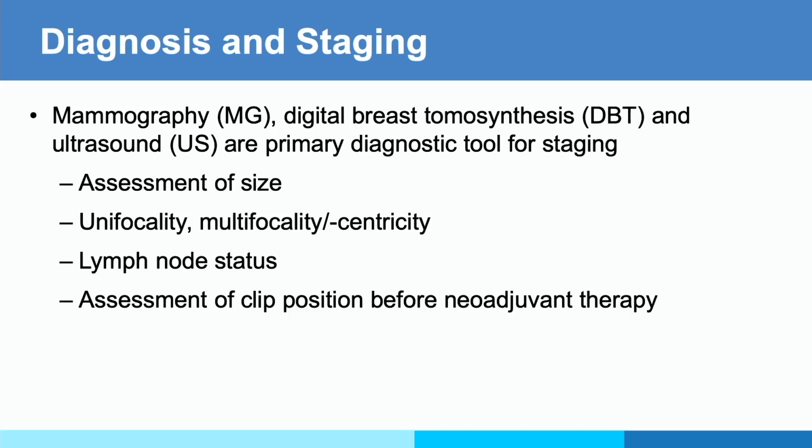And also, in particular, if the patient is going for neoadjuvant chemotherapy, which a large proportion of patients is currently going to, and also with neoendocrine treatment pushing into the realm, is the clip actually appropriate? Because the intent is when the patient responds, you want to be able to offer the patient breast conservation afterwards, and you will still have to do a surgery. So we want to know, is the clip in the right position for planning the surgery in the end?